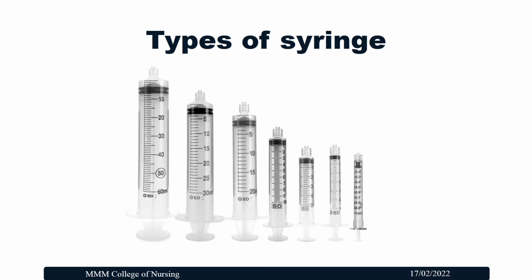The syringes can be classified into different sizes according to the amount of medicine that can be loaded in it. It can be a 1 ml syringe, 2 or 3 ml syringe, 5, 10, 20, likewise 50 ml syringes.